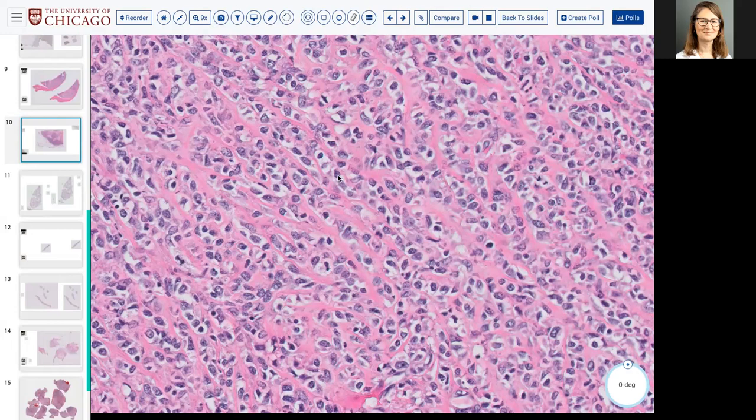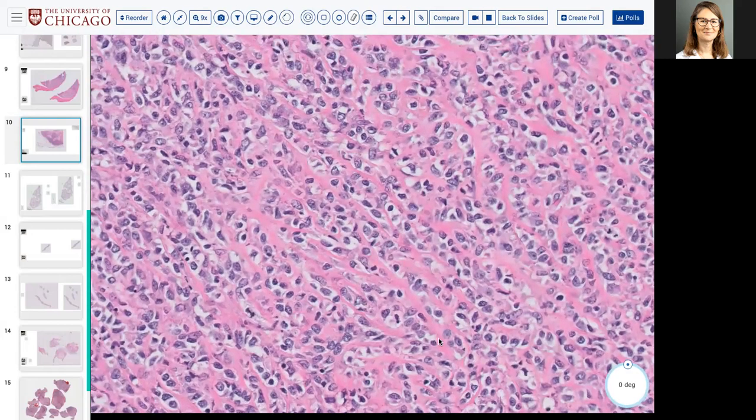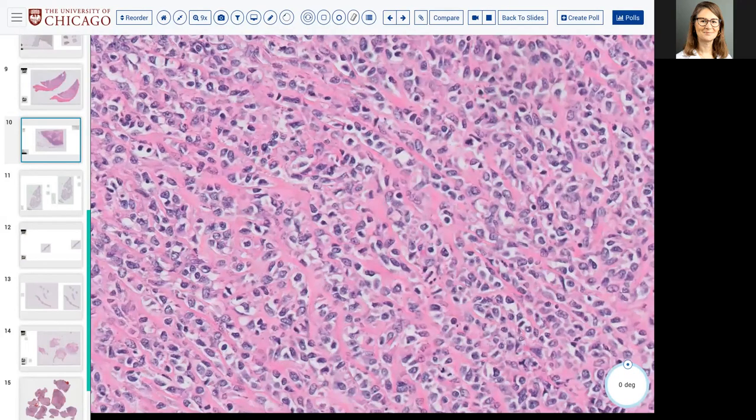So that's again the very subtle and very focal morphologic finding that's going to maybe clue you in. So these strands of very bright, which we saw earlier, separating these cells into cords, these hyalinizing sclerotic or collagenous bands are highly characteristic of quote unquote sclerosing epithelioid fibrosarcoma.